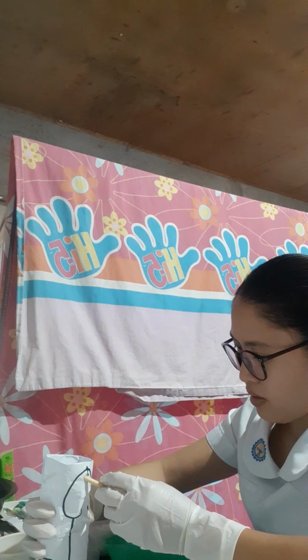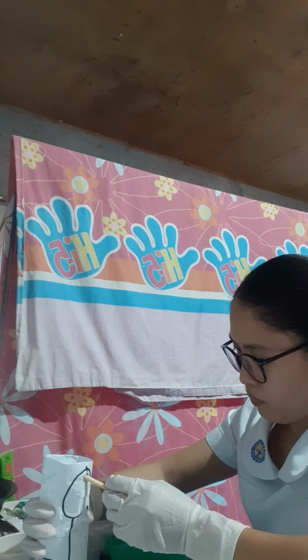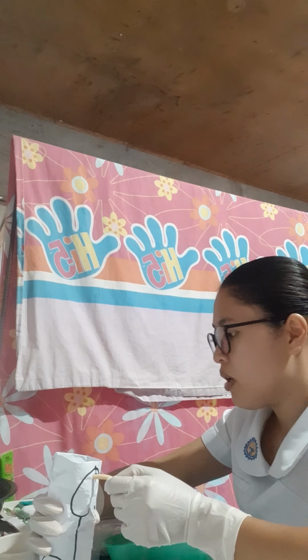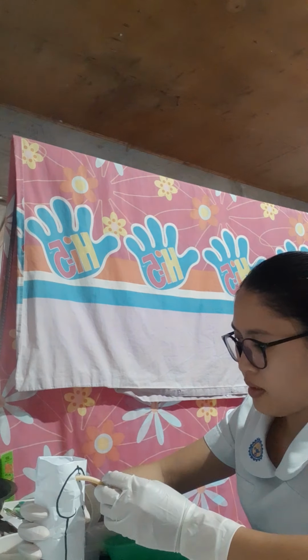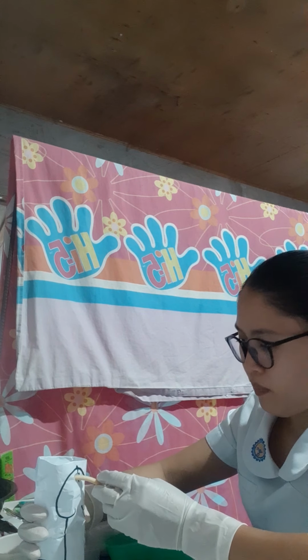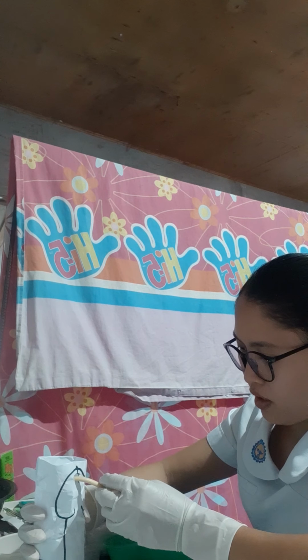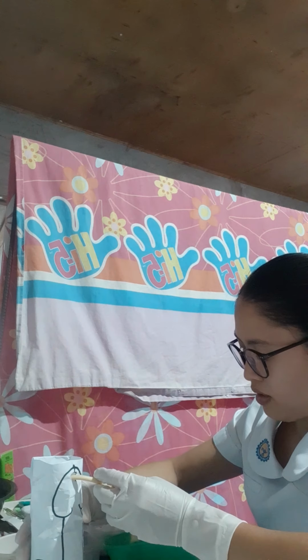When urine appears, advance the catheter another 5 cm, which is 2 inches. Do not force against resistance, because it may harm the client and cause bleeding. Then afterwards, lower the penis and hold the catheter securely in the non-dominant hand. Place the end of the catheter in the urine receptacle.